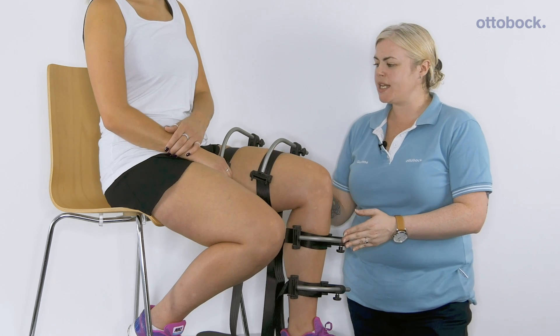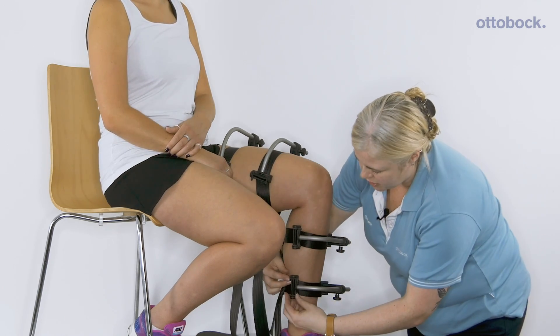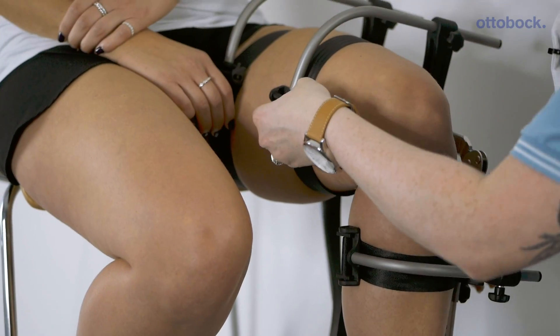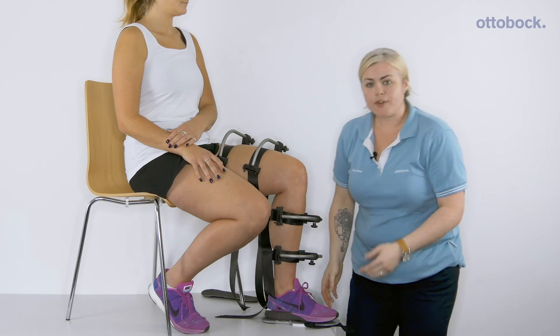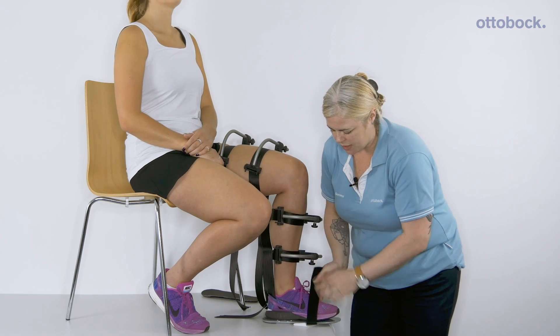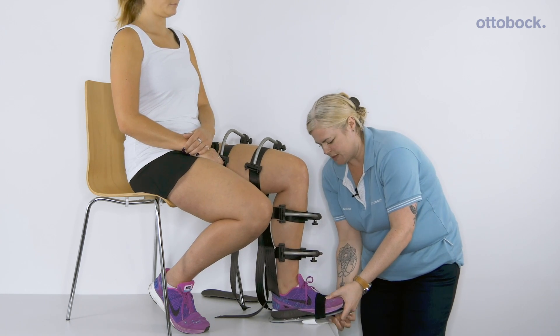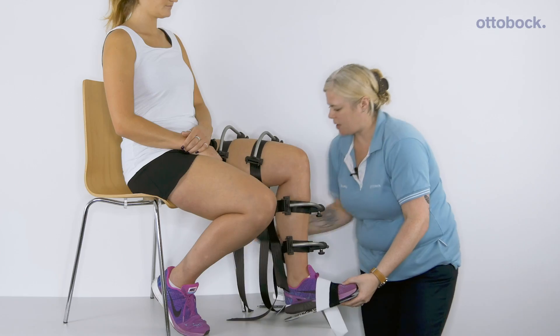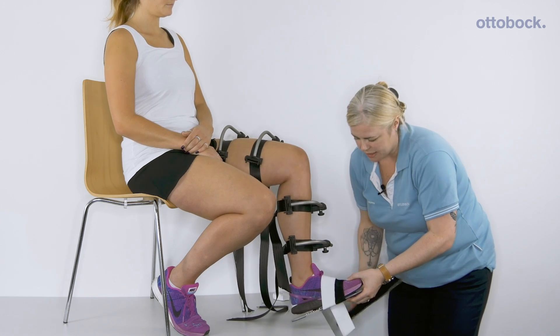Once you're happy with the tension on the straps, they can be locked in on the medial side mechanisms. Finally, we will secure the foot strap with two velcro straps and then attach the walk-in base.